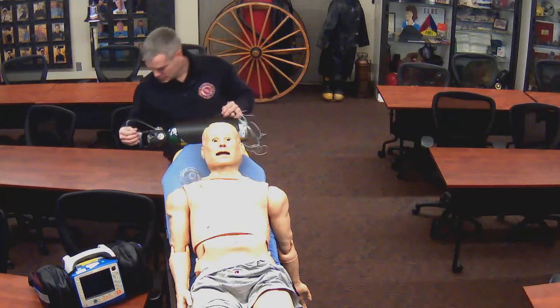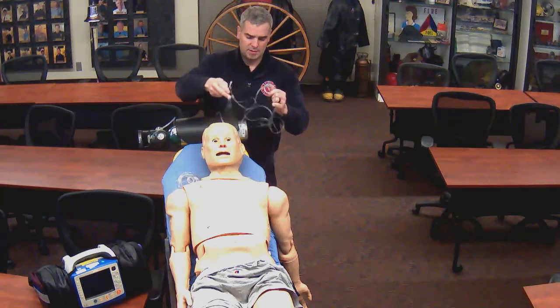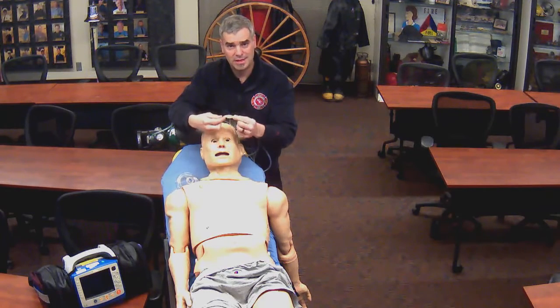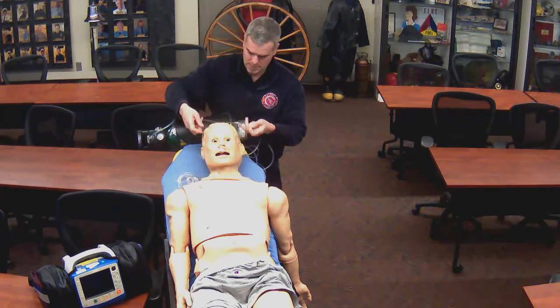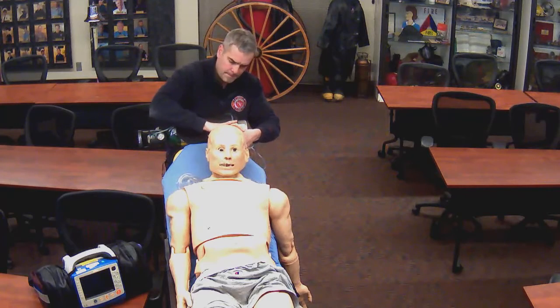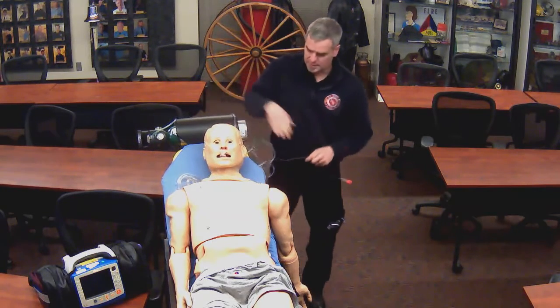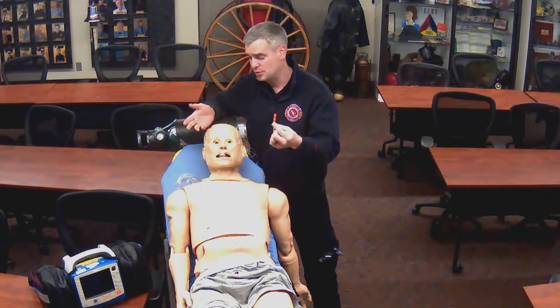So we have the oxygen applied here for our ETCO2. We've got it flowing, and we apply the cannula to the patient. You'll notice that there are prongs that go inside the patient's nose, and then a little cup down here that's actually suctioning in the CO2 and sending it to the monitor. So we'll do our tomahawk approach here for the patient. The other side of the cannula has this quarter or half turn luer that will apply to the side of the monitor, and I'll show you that momentarily.